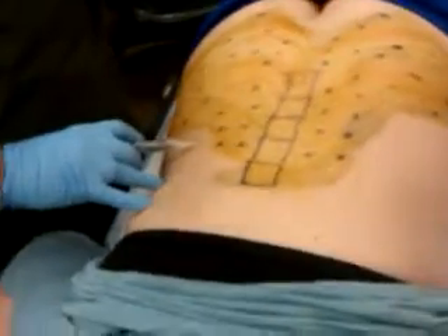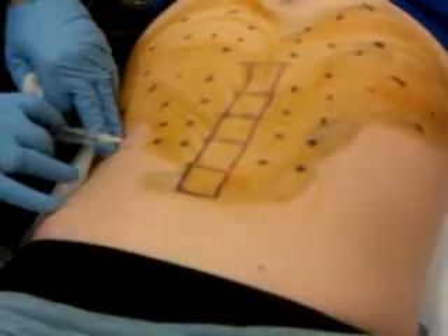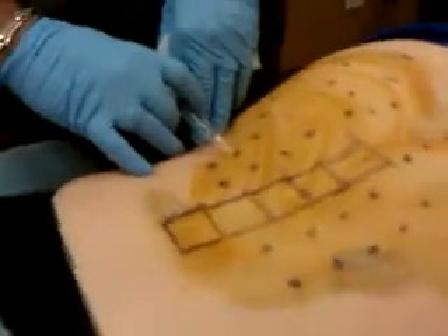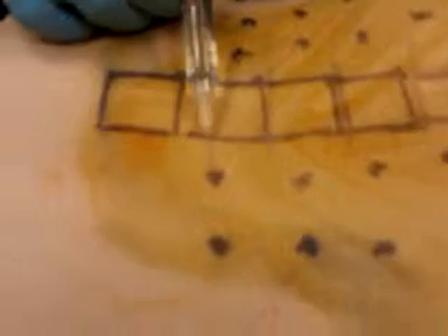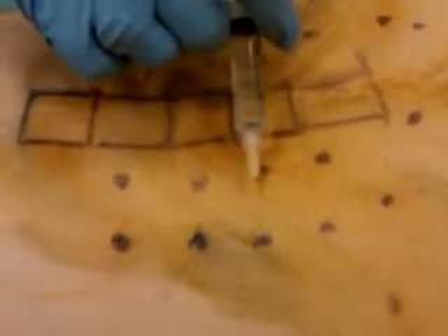So we're going to start — this is the small one-inch, so we can lay it flat. It's not going to hurt as much. That's a big difference. Still it burns, but not as much. That can never be pleasant, but it doesn't hurt half as bad as it did before. That's the only difference in the needle — because I can lay it flat and go under a very, very sharp angle.